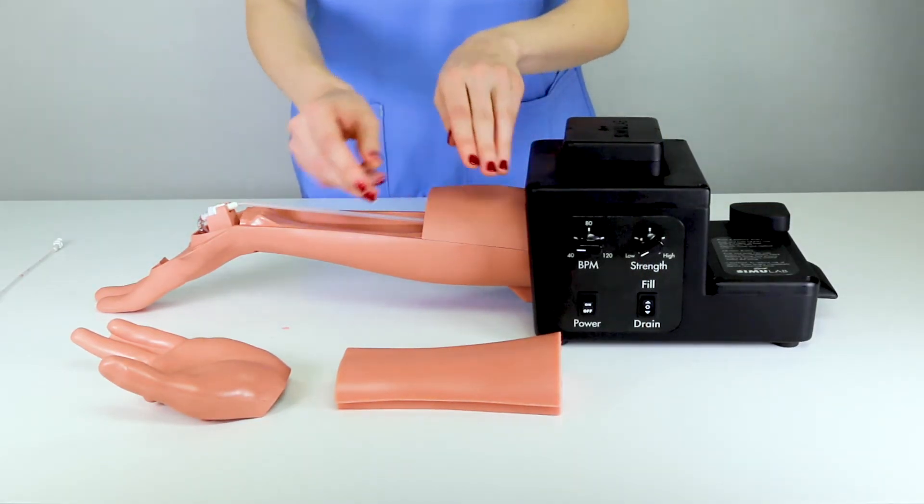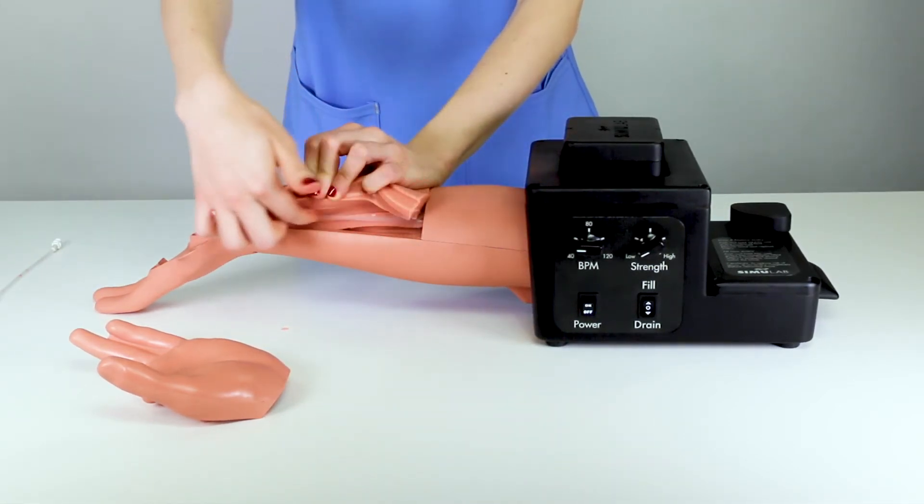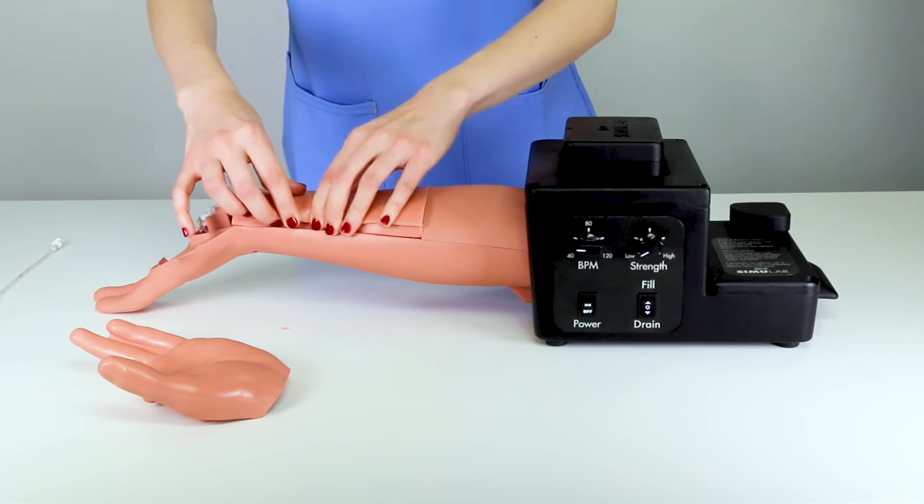Replace the arm cap and reinstall the tissue. With the new artery installed, power the trainer on.